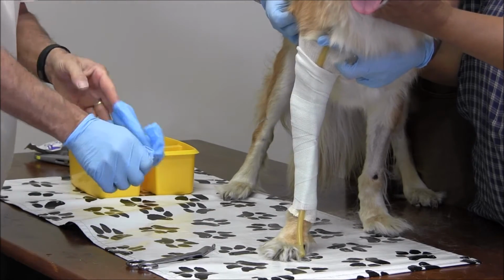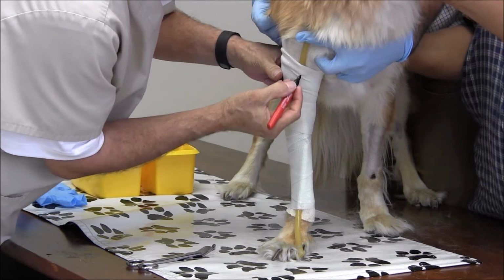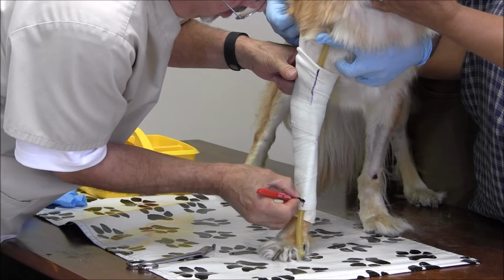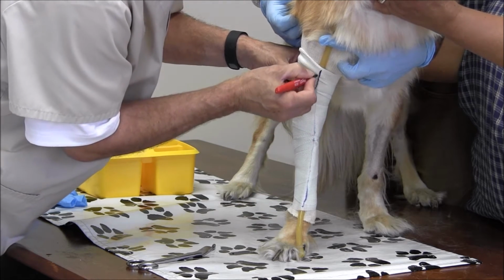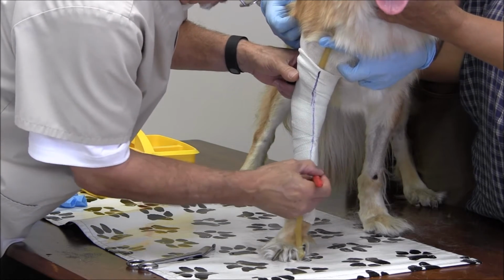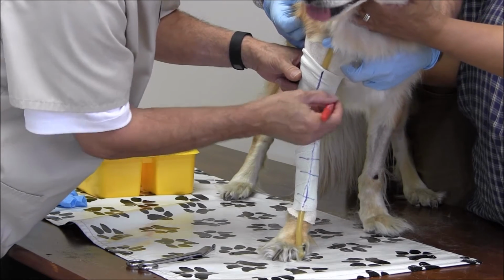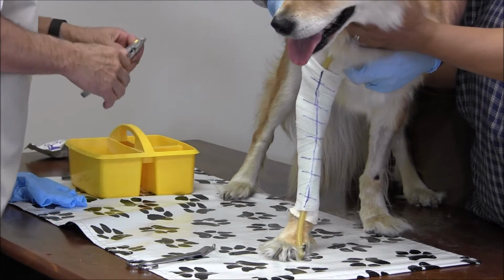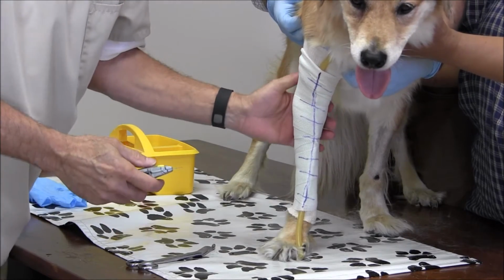Now that's almost hard, and what we're going to do now is take a marker, and we're going to mark just where that tube is. And then we're going to go ahead and put little hash marks where the tube is. This way we know where to cut it off. Now this is almost ready, and I think we can go ahead and cut it off now.